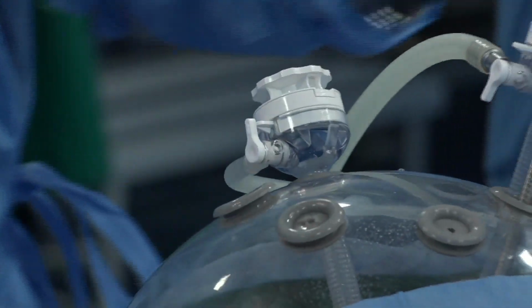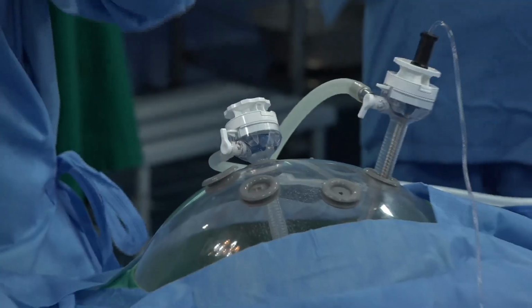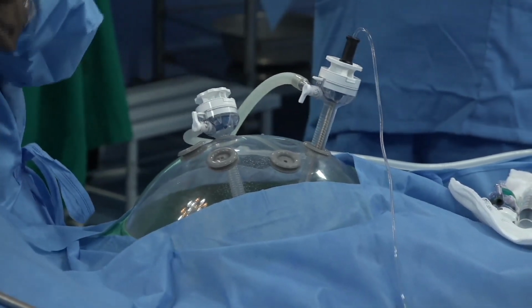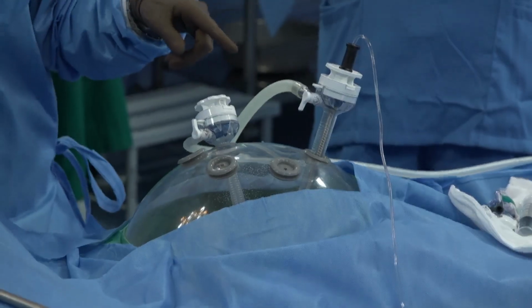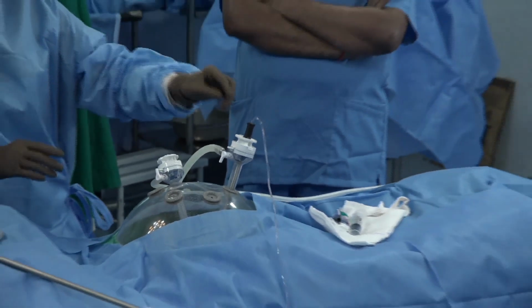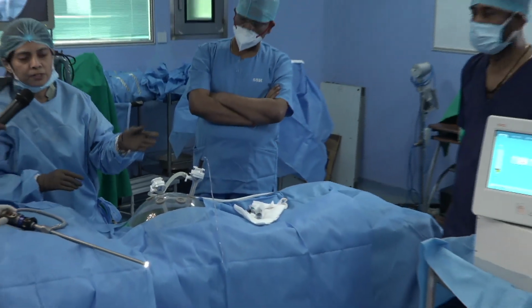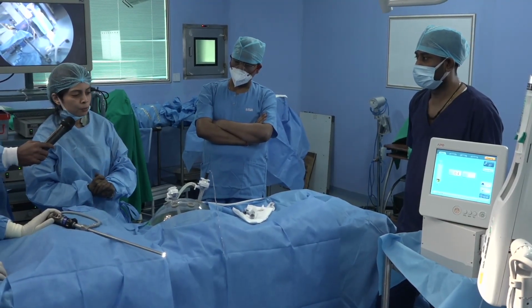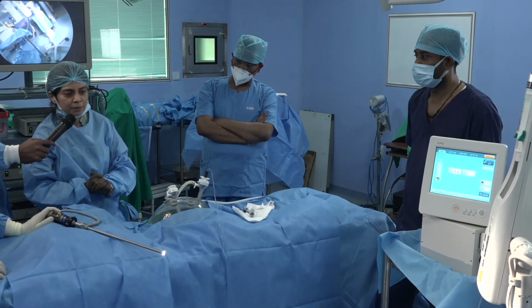And once everything is primed up like this, the anesthetist and all the OT team move out. I repeat, all of them have to move out of the theater. And then we start the charging system. Now this spray will continue for about 7 minutes. Thereafter, we have to wait for another 30 minutes. So the whole procedure is not more than 45 minutes overall.